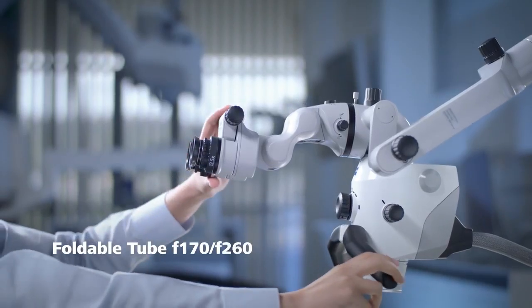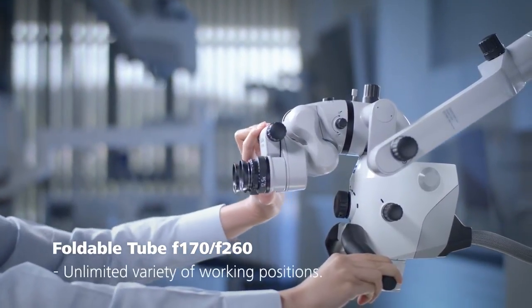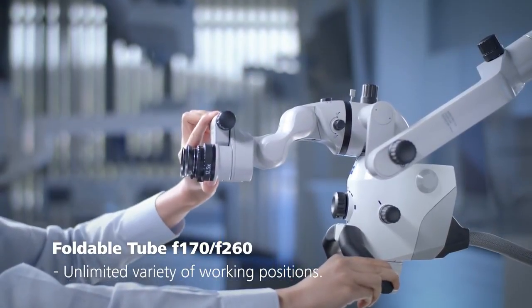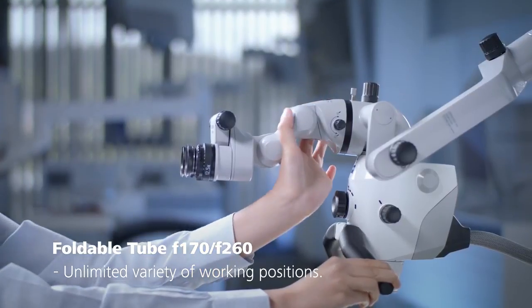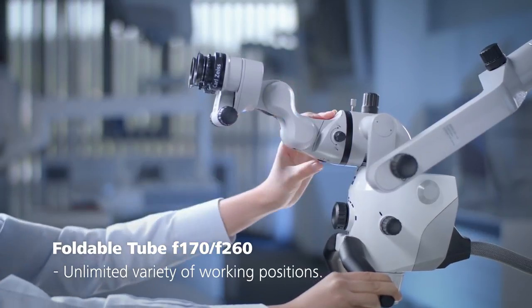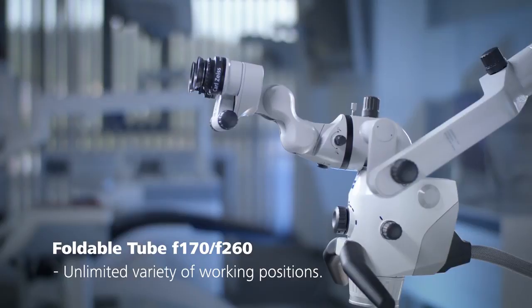The foldable tube F170-F260 gives you an almost unlimited variety of working positions. Thanks to the patented design, it can be extended, retracted and rotated. The foldable tube F170-F260 easily accommodates different personal ergonomics, different operators and different patient positions.